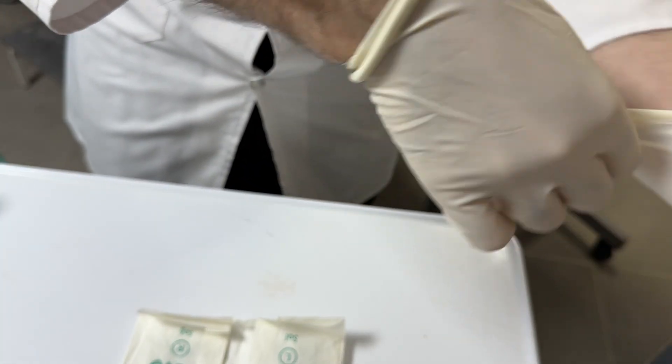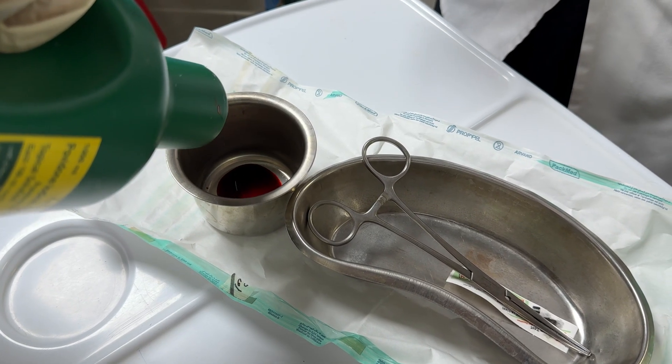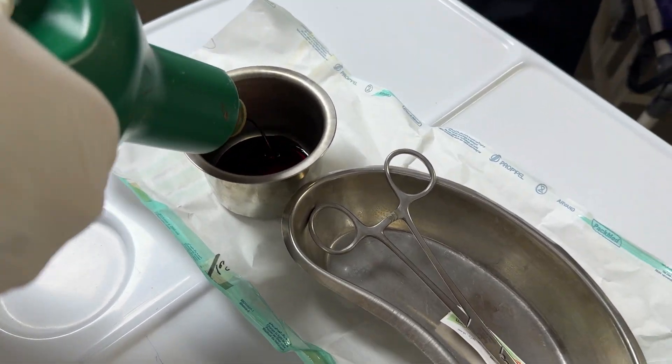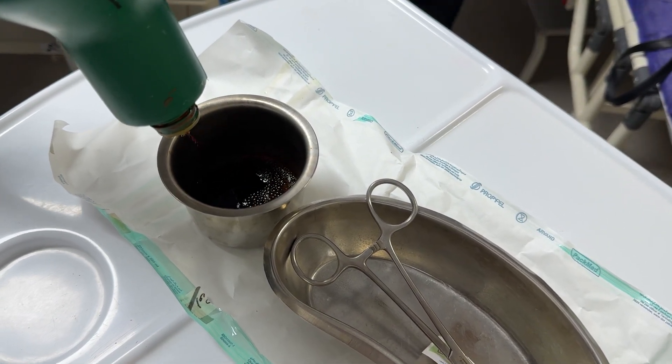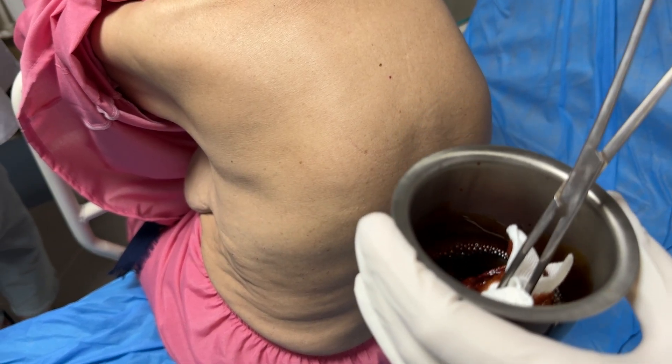Our job today is to help her breathe easier by performing a therapeutic thoracentesis. This isn't just a procedure — it's a direct intervention to improve her quality of life. Let's walk through how we do this safely and effectively.